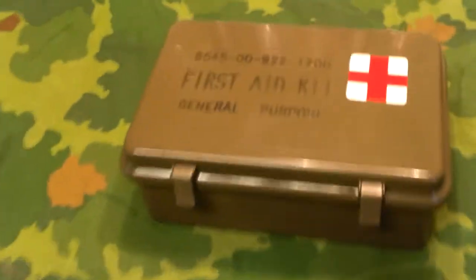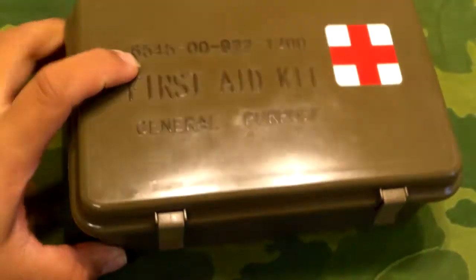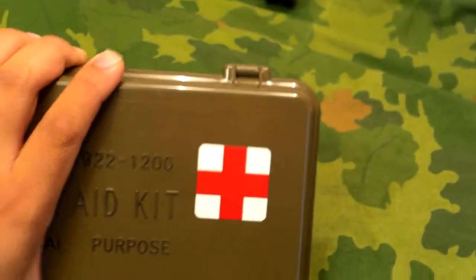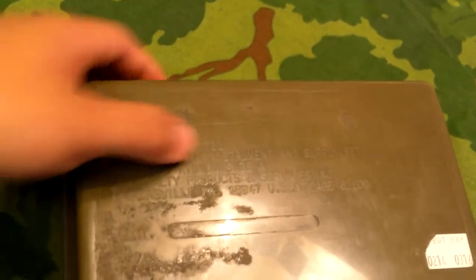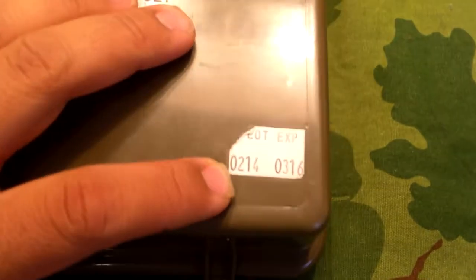Here is the next kit I have for review. This is the first aid kit, general purpose. It's got the national stock number, says what it is, and has the universal red cross symbol for medical or first aid. On the bottom it has the national stock number again and it says: case medical instruments and supply set, plastic rigid, size A, Specialty Products and Services Incorporated, Pipersville PA, with their zip code and cage number.